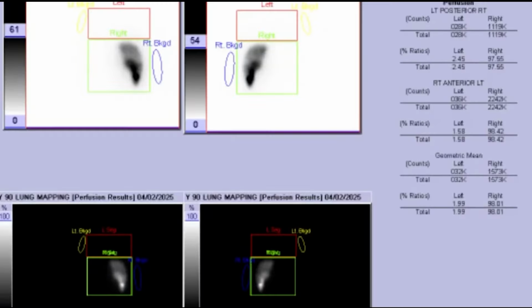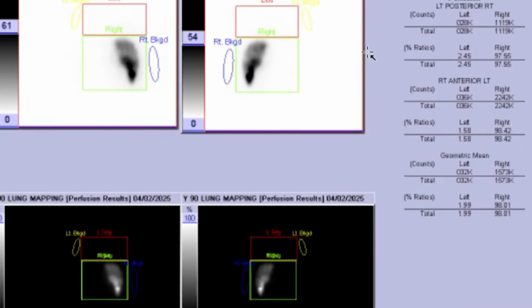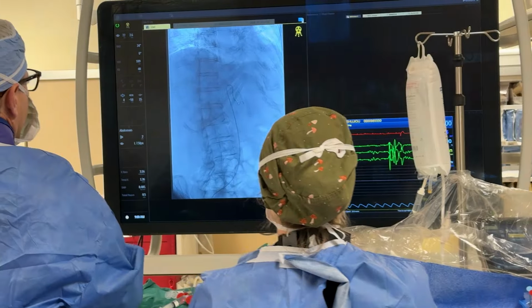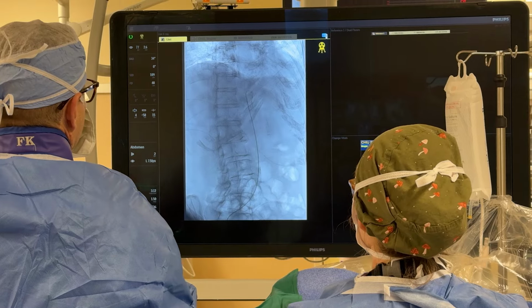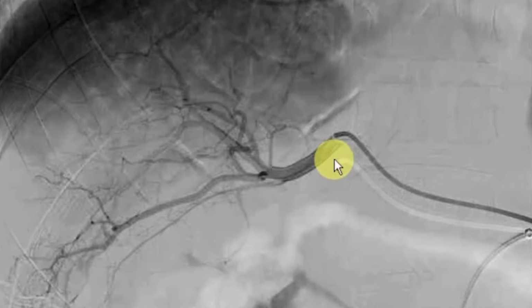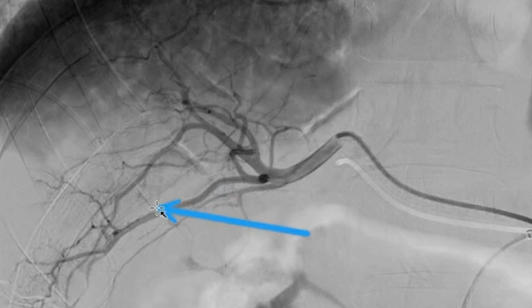After we complete the initial evaluation, in most cases, we plan a mapping procedure. You can think of a mapping procedure as a rehearsal. So in those procedures, we put a catheter in the groin or in the wrist, and under imaging, we navigate this catheter to the artery going to the liver. And when we have the catheter in the liver, we use a fancy imaging that we have in the cath lab called a cone beam CT, with which we can do a 3D volume imaging of your liver. And in the mapping, we can isolate any particular blood vessel that we think is going to the tumor area and that we're thinking of treating.